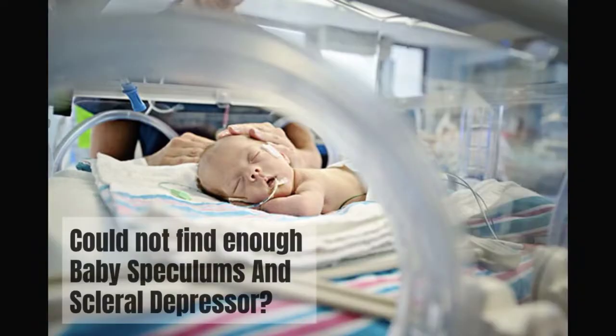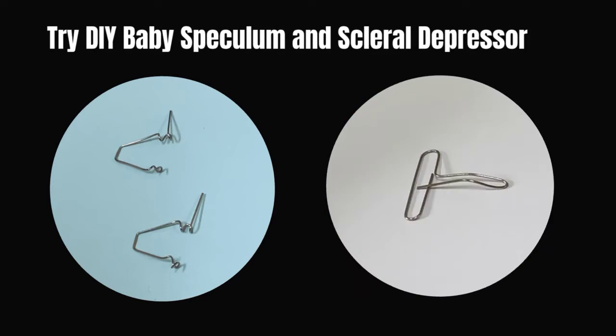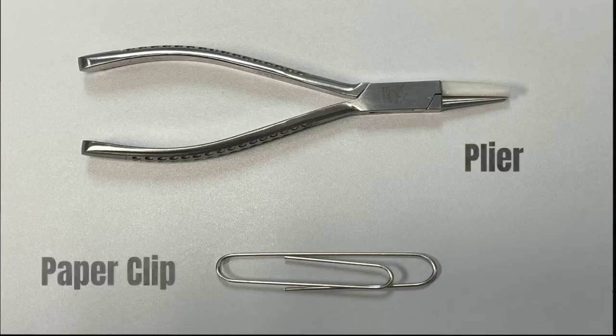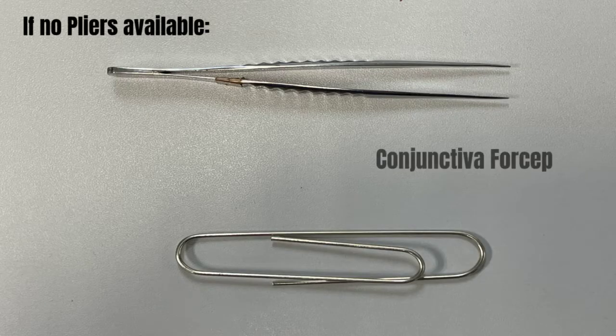Could not find enough baby speculums and scleral depressors during ROP examination? Try DIY baby speculum and scleral depressor. Here's what you need for the DIY: a plier and a paper clip. If no plier is available, use conjunctiva forceps instead.